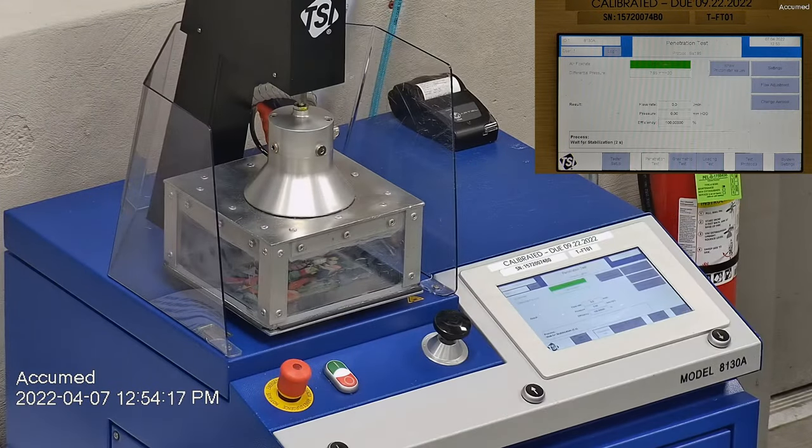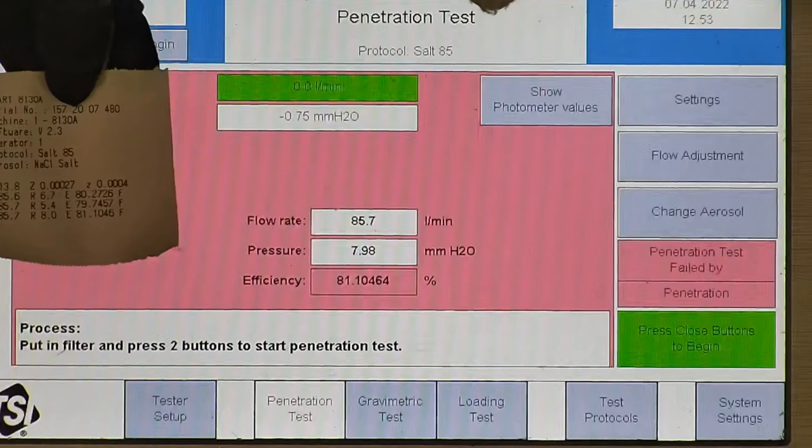Let's go over the results. F stands for air flow rate, which we test at 85 liters per minute. R is for resistance, also referred to as pressure drop — this correlates with breathability, so the lower the number the more comfortable and breathable the mask is. E stands for filtration efficiency percentage. The filtration percentage for all three samples was between 79 to 81 percent.